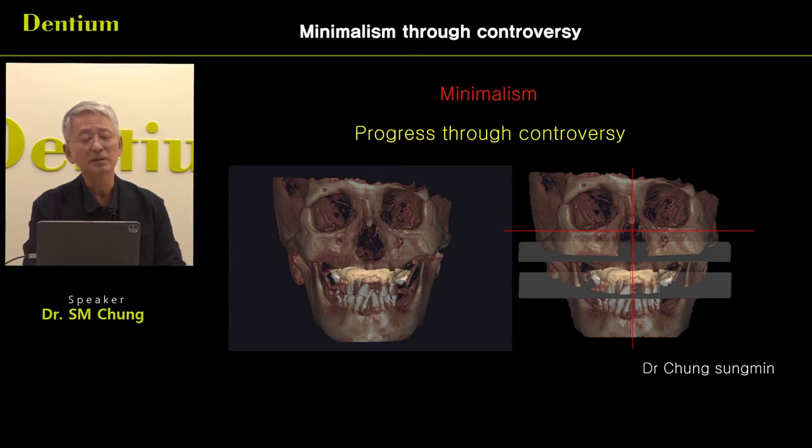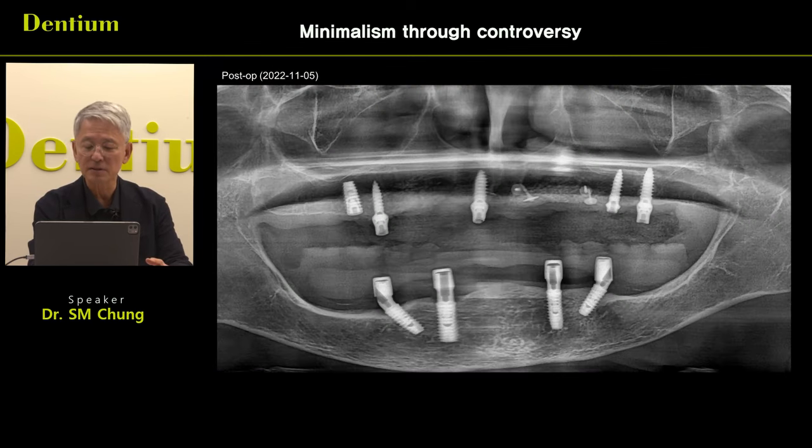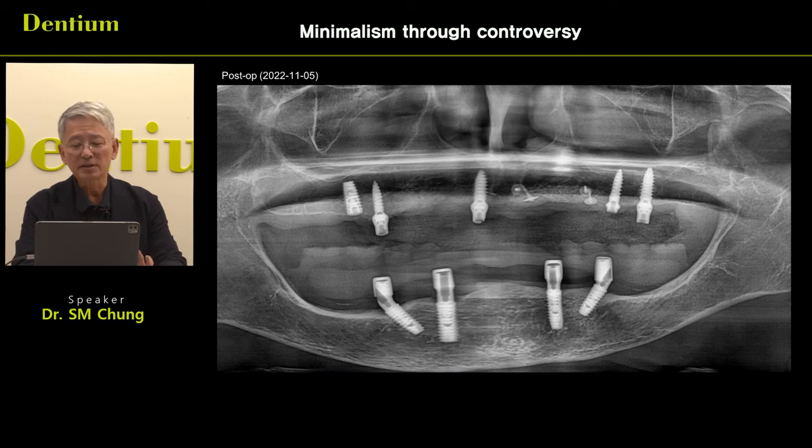This is a real patient, with stitching of the cone beam CT and the intraoral scanning. With that, we can make occlusal planes, so we can treat edentulous dentitions very conveniently. In the lower jaw we had placed 4 implants and a fixed hybrid prosthesis. But the patient also wanted implants in the upper jaw as a fixed prosthesis. With a complete denture, it is very difficult to restore with a fixed prosthesis because there are very thin alveolar ridges.